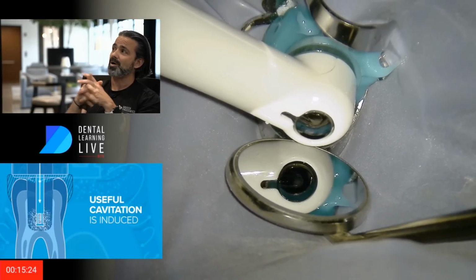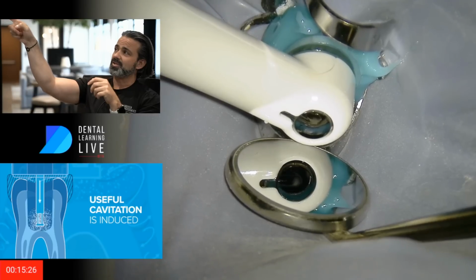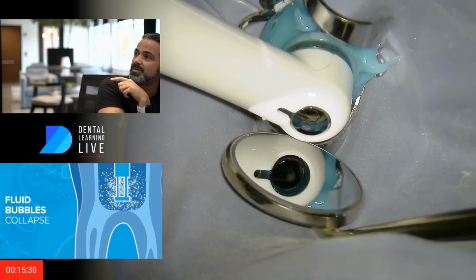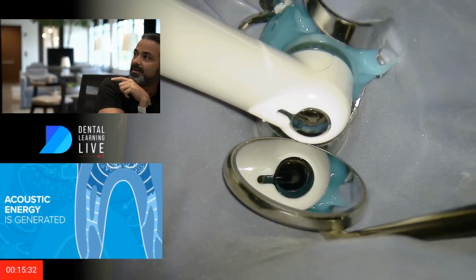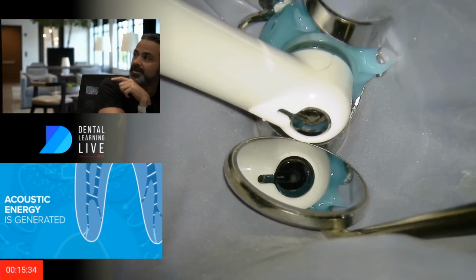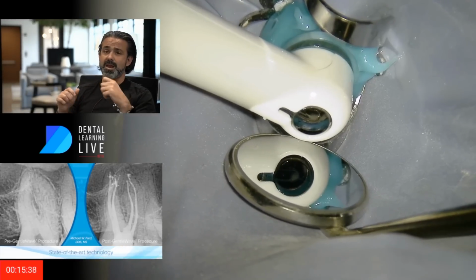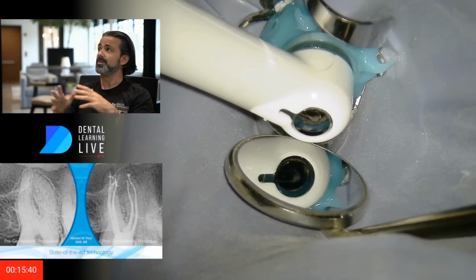So there's not a sound bar. The sound bar is really that head. Now you can see it in the window, and just to the left of the window right here is the vent. So one thing you want to do is look at that vent and never have it blocked. That wouldn't be good.